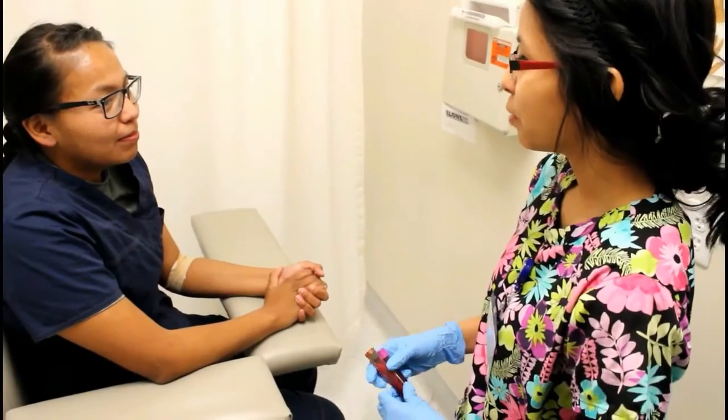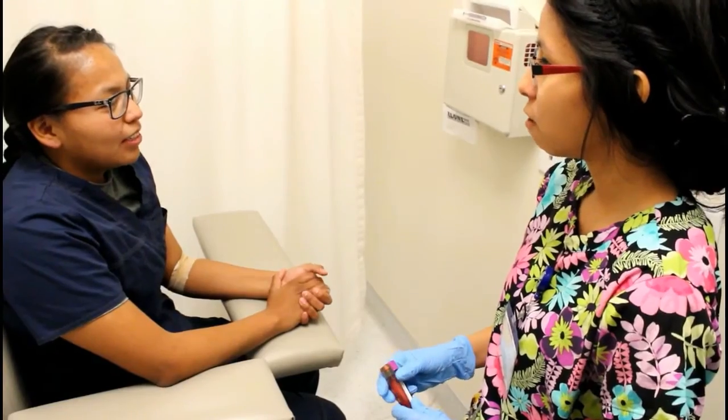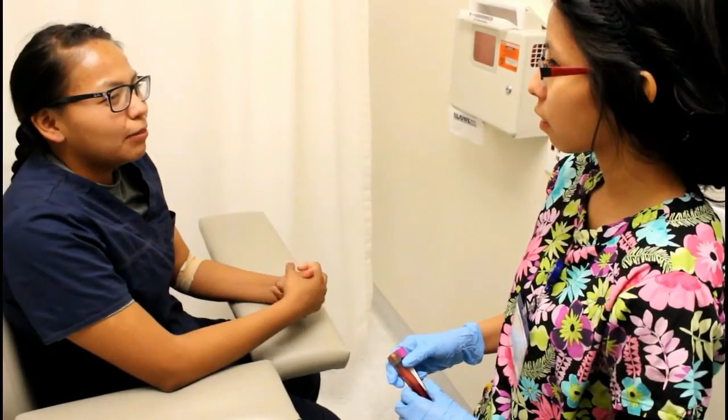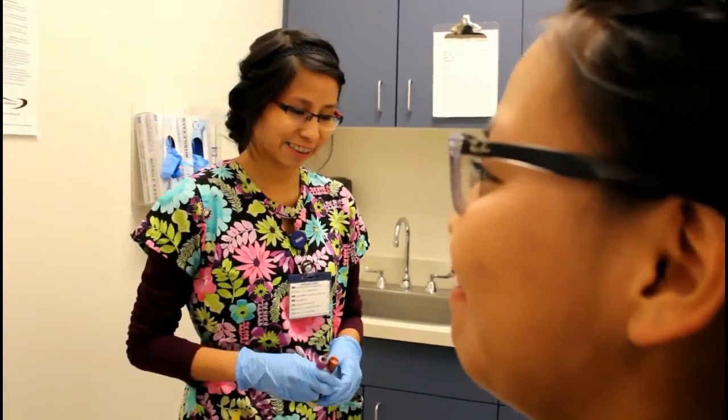Thank the patient and see if they have any questions or need anything. Are you feeling dizzy, lightheaded? No, but I have a question. When will my results be in? The test we're running takes about an hour or 2. The results will be given to your doctor. You can notify him. Okay. Thank you. Thank you.